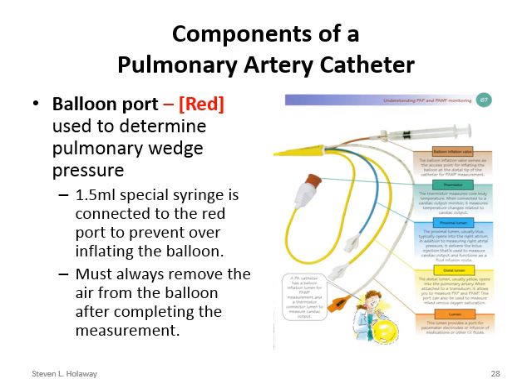That's why many places have gone away from actually looking at a wedge pressure. There have been instances where the nurse, the physician, whoever's doing the measurement did not remove the air from the balloon when they finished doing the wedge pressure, and basically we got necrosis of a part of the lung.